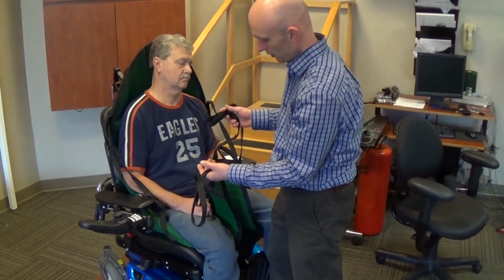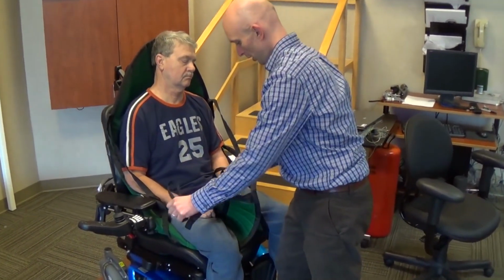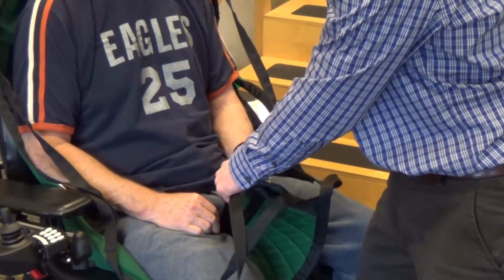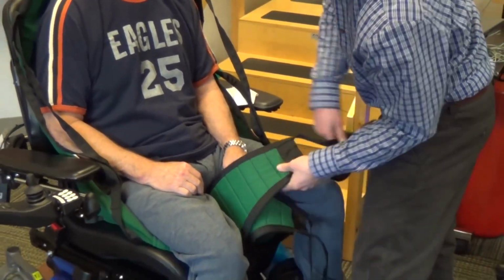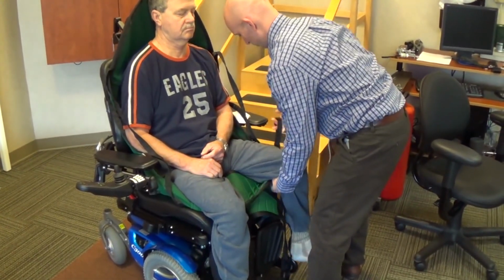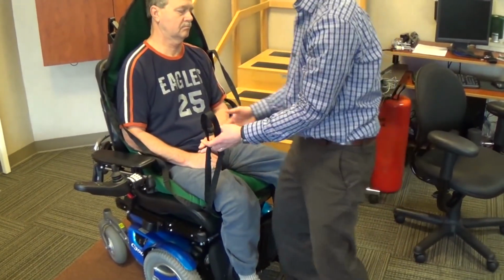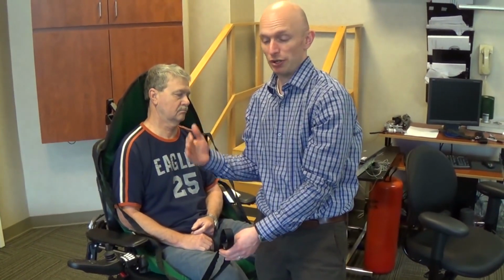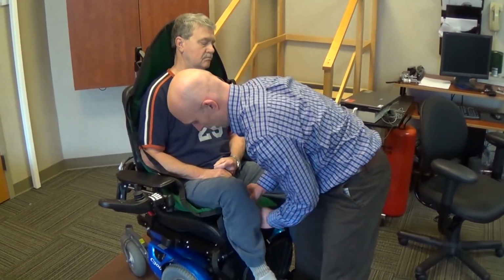There's different methods with the leg straps. Frequently crossing through keeps the person from sliding through the hole, as it prevents a gap, a stop here. And then you can also move the straps, crossing under both legs, as such, without crisscrossing. If the person's wearing slick athletic pants, this typically has worked in the past to keep them from sliding forward as much. But we'll use the more traditional method of crossing the straps.